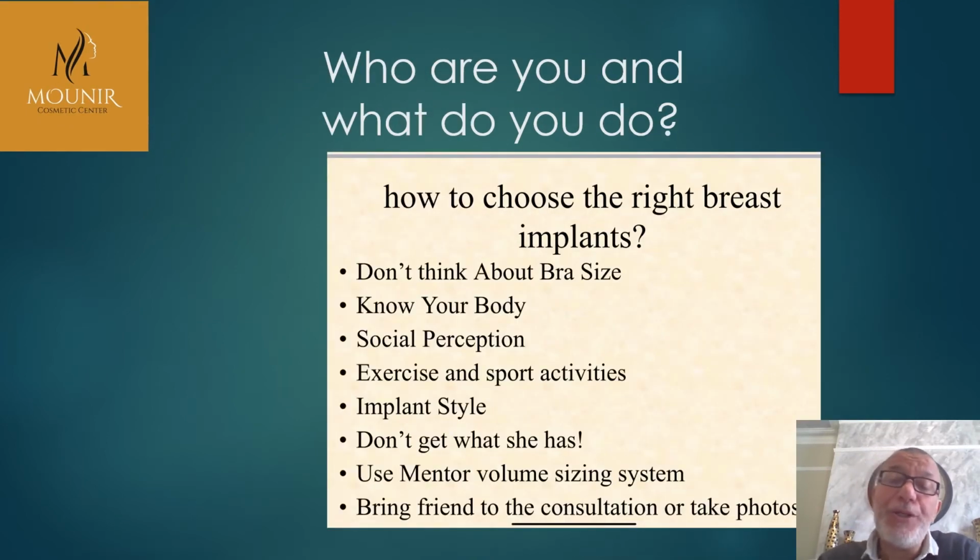Now, in order to go through this process, choosing the implant size is really a process. Performing a breast enhancement on a patient is really a journey. And really, the consultation is the first step in that journey, in my opinion. Because the surgeon needs to know who you are and what you do, who you are in terms of life activity. Are you an athlete? Are you a bodybuilder? Are you somebody physical? Which kind of work do you do? Do you work using your arm, your muscles, your pectoralis muscle?